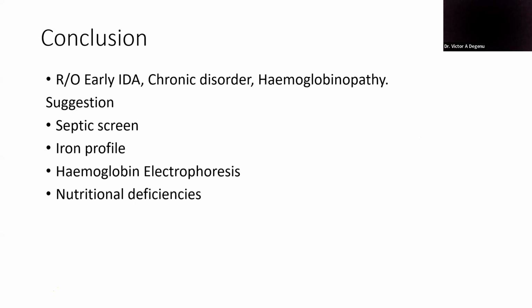Okay. So you may go on to suggest that there'll be septic screen for the increased WBC, iron profile, hemoglobin electrophoresis, and nutritional deficiencies. Okay, so let's go back a little.